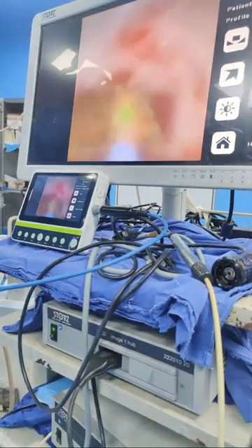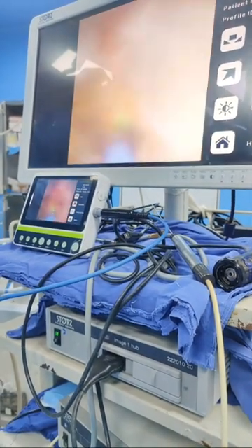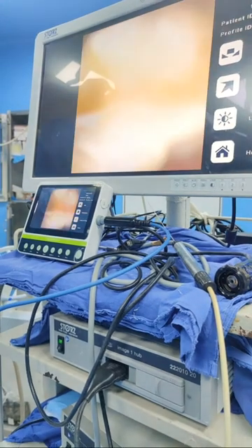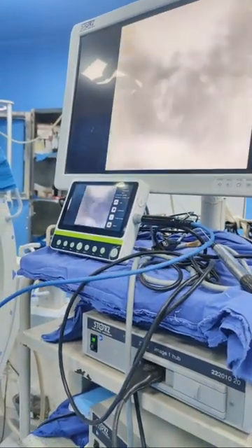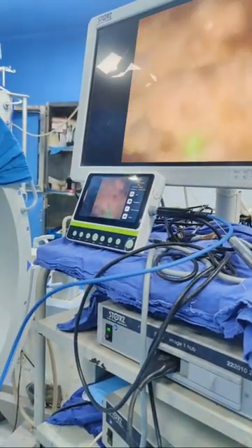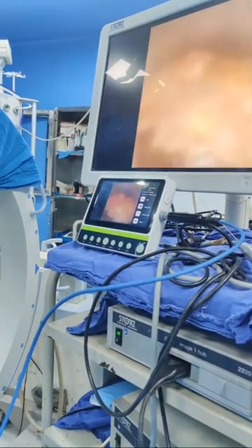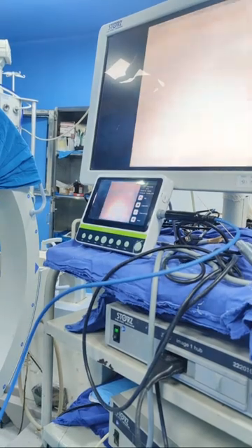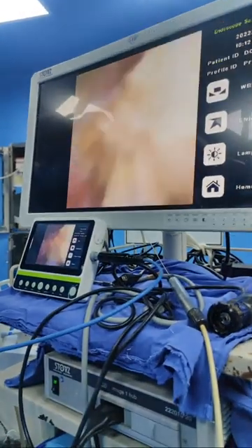The moment you see there are a lot of stones which are bigger than the size of the space, then you withdraw and all will come out. And in a compact system, the suction will work very well. Even in a dilated system, what would happen is that the system will collapse because of the suction. So in the dilated system it will not work as well, so it will keep moving.